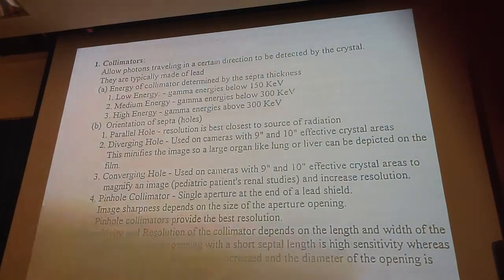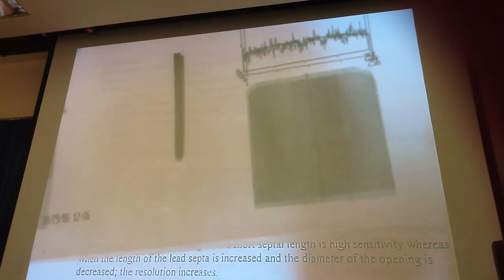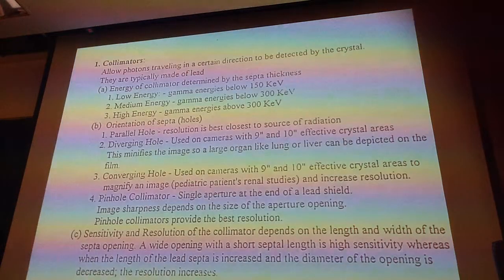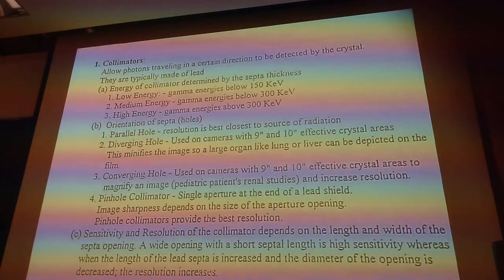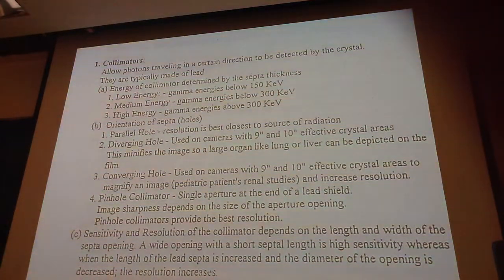By the way, want to see more? When you have two images that you put together like this, because there's 64 lines in there, see how we can create a moire effect with that? Well, what it's saying is that even the scanning rate of your computer can create a moire effect you need to be aware of.